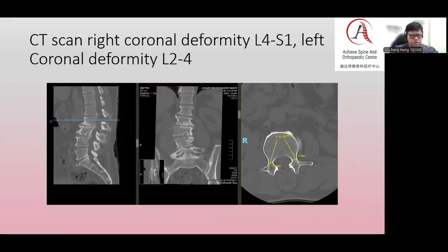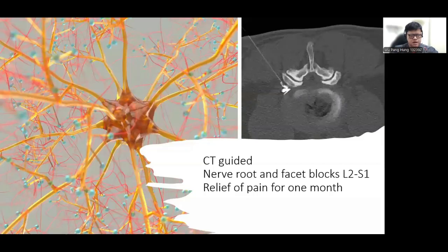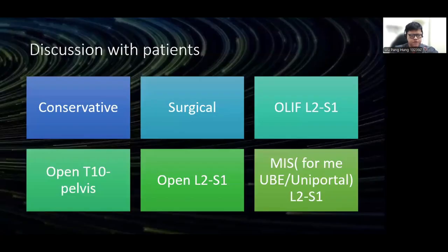CT scan shows, as well as X-ray shows, there is a coronal deformity on the right side. It is coronally deformed at the L4-5, L5-S1, and then the L2-3, L3-4 is more of coronally tilted towards the left. It is CT-guided nerve block, and there's a relief of pain for 1 month. And the patient was given options of conservative treatment or surgery.